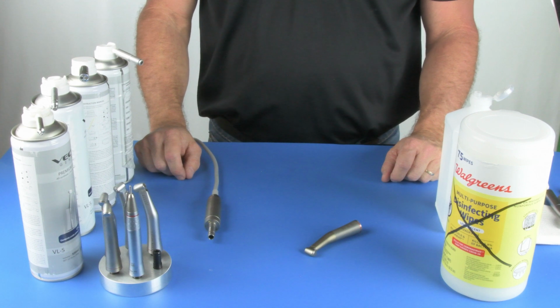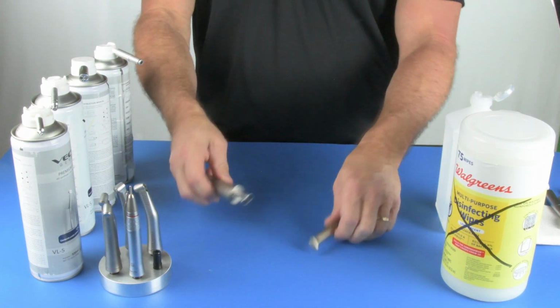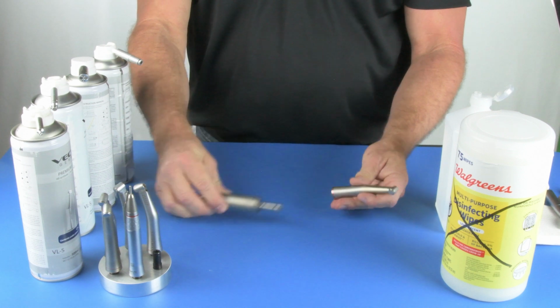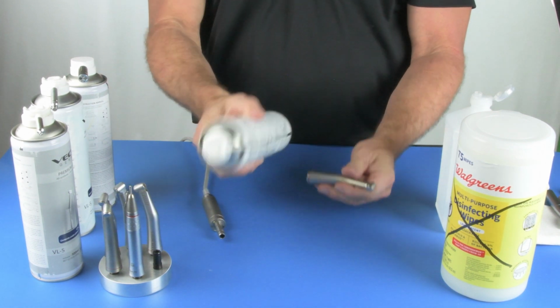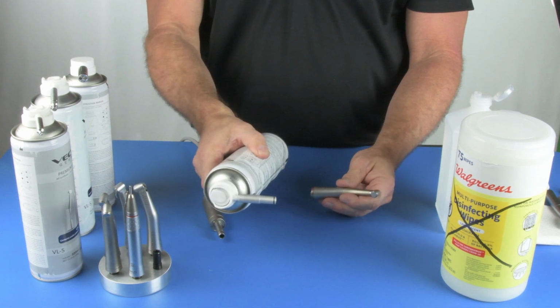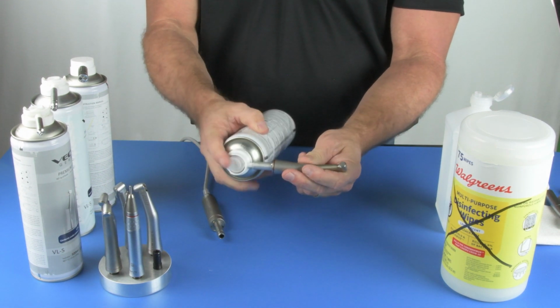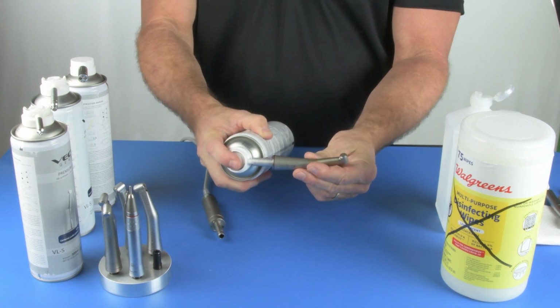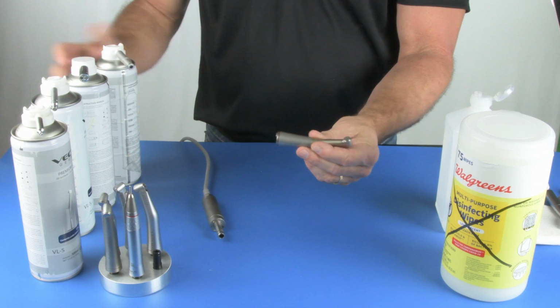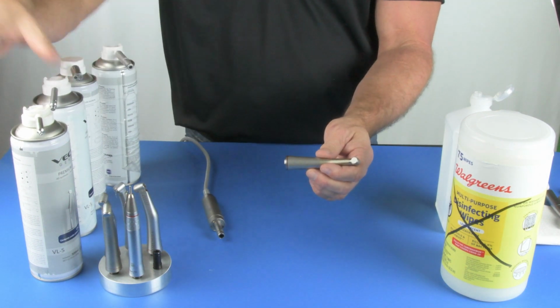Let's talk about lubricating electric handpieces. Electric handpieces can be identified as the ones that fit generally on electric motors. They are E-type handpieces. You use a very specific nozzle. It is very important that you use the E-type nozzle correctly. They have to fit onto the nozzle and have a tight fit as it's spraying forward all the way through the handpiece to clean it out. Any other nozzle would be wrong and will not lubricate the handpiece correctly.